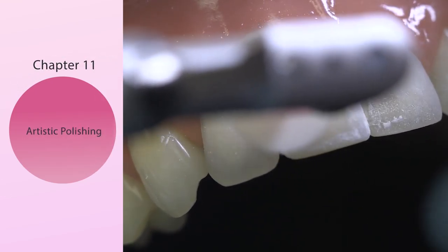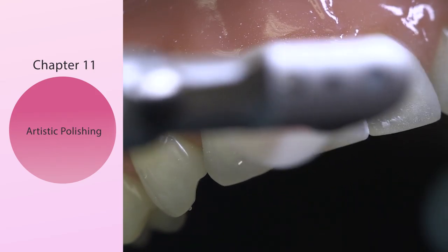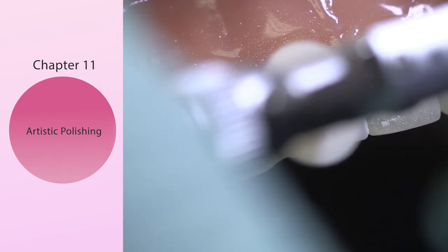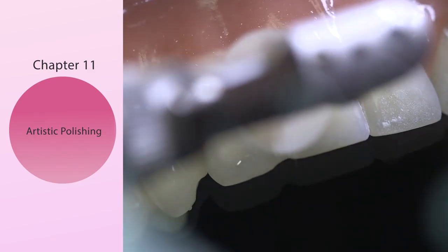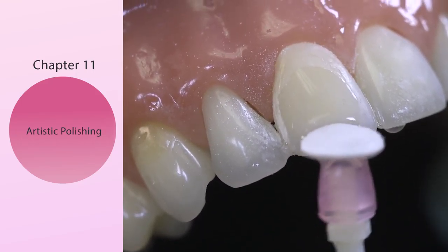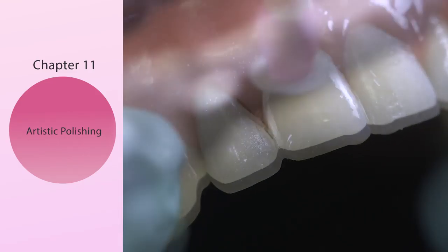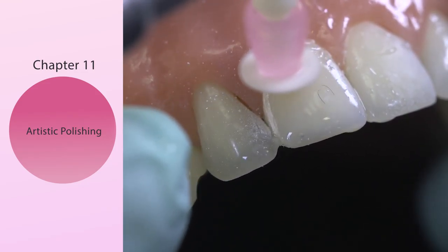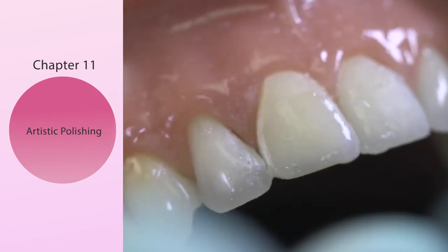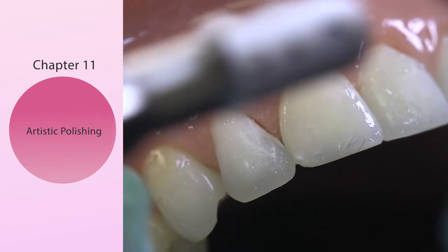Use a very light touch — you don't want to hear the drop in RPMs too much. You don't want to be torquing on this because it's not necessary; you've already created a very uniform surface, so you just want to hit the high points. After the buff disc, let's go to the mini buff disc — this is a smaller version. Go into your interproximal area; you can see the mesial transitional line angle is already reflective. Elevate the disc so you can crop right around and edge around the cervical margin. This is Zone 1, this is Zone 2. Get into your interproximals, into your incisal — beveled about 30 degrees here — and then do your incisal.